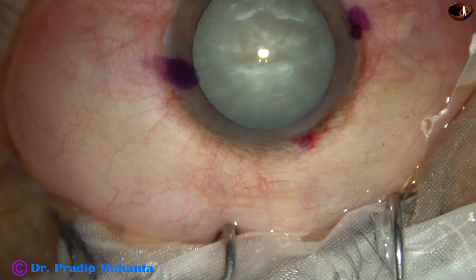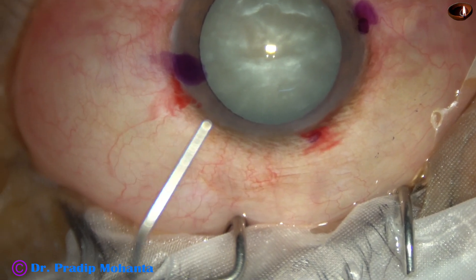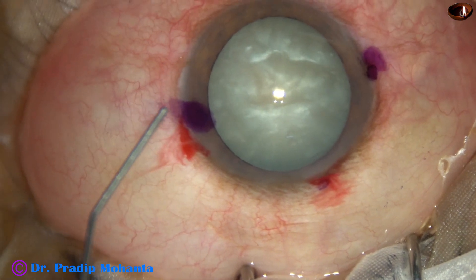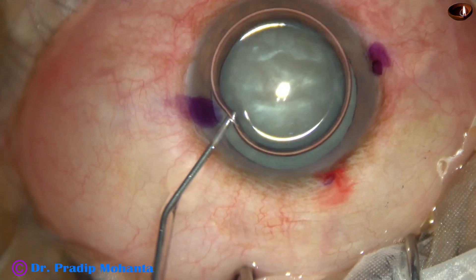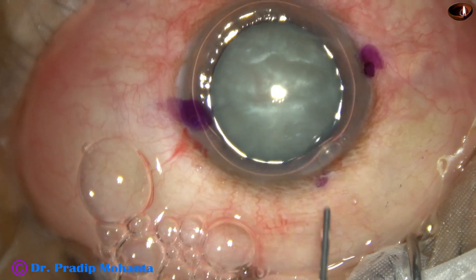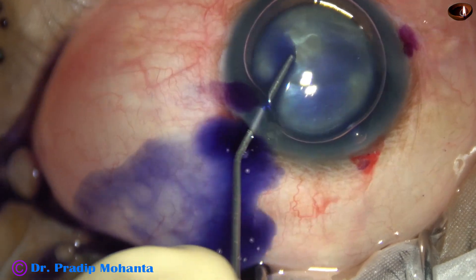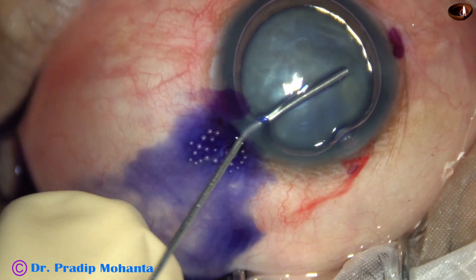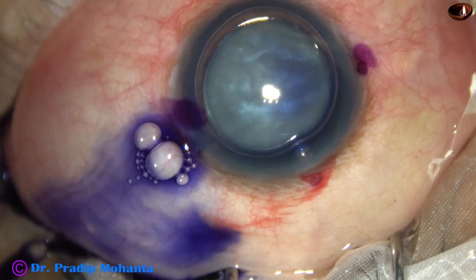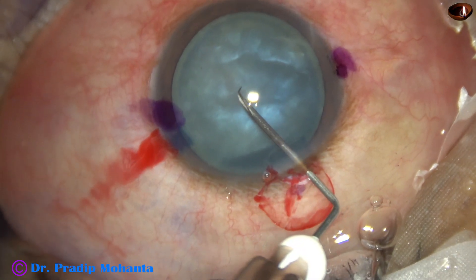The main incision has been made at 11:30 o'clock. An air bubble is injected into the anterior chamber. Now, trypan blue dye is applied over the anterior capsule all around so that uniform staining of the anterior capsule occurs.